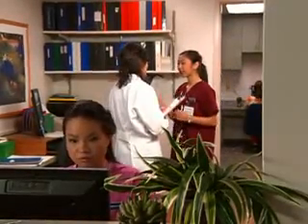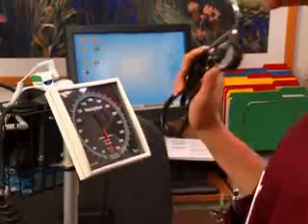Okay, and what's next? I'm going to be getting the vital signs on my patient as part of my assessment. Do you have everything you need? Yes, I think so. Digital thermometer, blood pressure cuff. Is it the right size for your patient? Yes, and of course, a stethoscope.